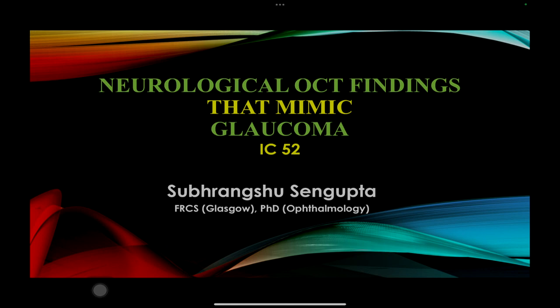And in those patients, even early on, you would start with a 10-2 and a GCA rather than 24-2 and RNFL. So that's just an example. Absolutely. So understanding the OCT is important. And I like the fact that you showed that sometimes when the 24-2 is gone and you have a central defect, I would follow all of these with 10-2 only. I wouldn't even order a 24-2.